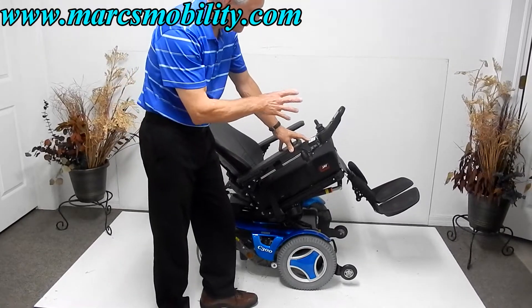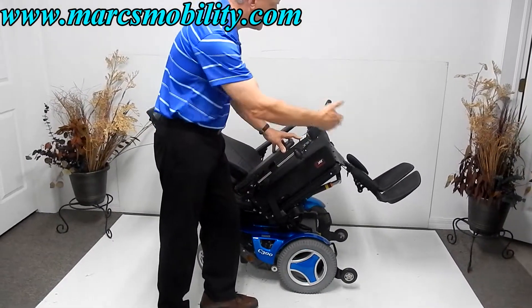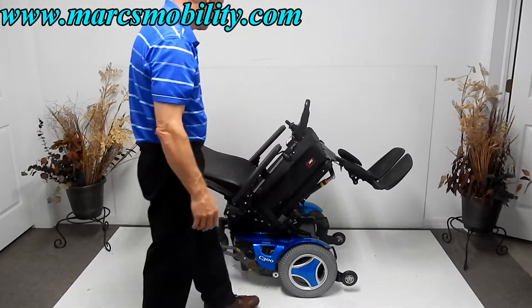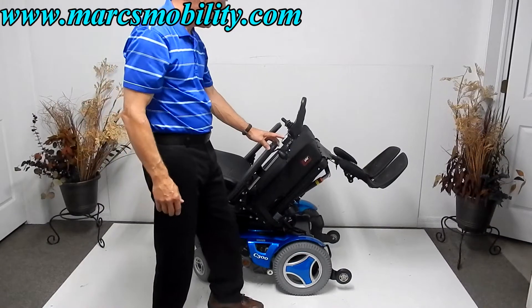The footplates are adjustable as well. We can adjust the length depending on your height — whether you're six feet tall or five feet tall, that makes a big difference. I'm going to bring the tilt back down now.